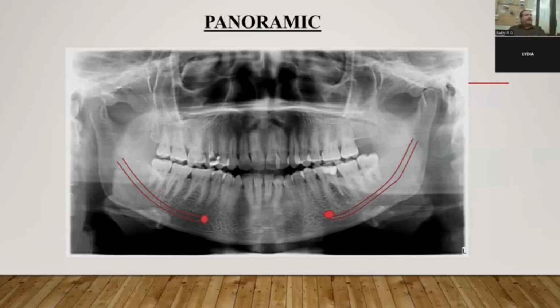And the grafting should have an augmentation with growth factors, not just a dry bone graft in that region. Try something like a growth factor addition. So you can go in for PRF mixed with bone graft or your sticky bone with an APRF membrane, which will be very useful in this case, because you're going to place an implant with a jumping space which needs bone grafting. So you can give additional support with a barrier membrane over it, which contains growth factors. That is your APRF membrane.